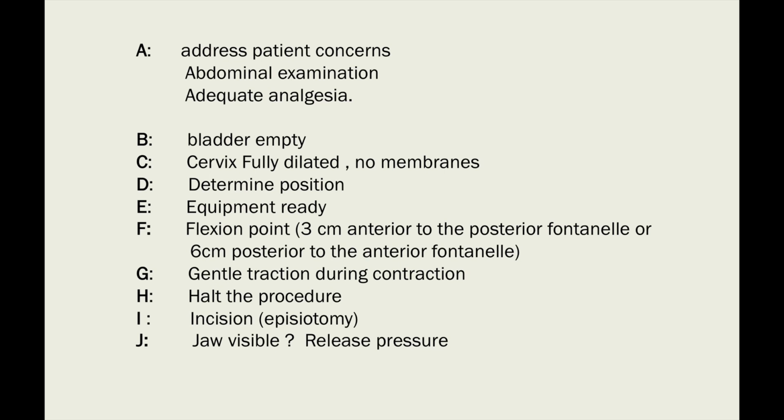There will be a specified midwife or member of staff who is documenting the time of the application of the cup, how many pulls you have, the duration of each pull, and how many contractions. All of these items should be recorded. If there are any tears or any complication, and how the baby is, everything should be documented in place. Okay, do you understand what I told you so far?